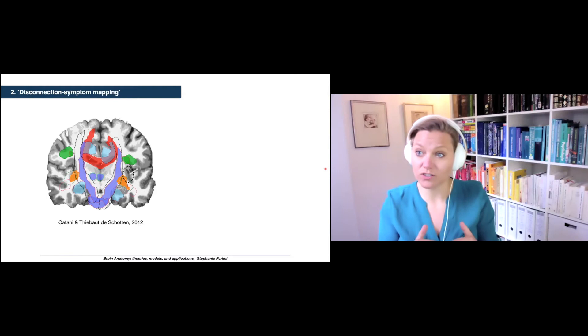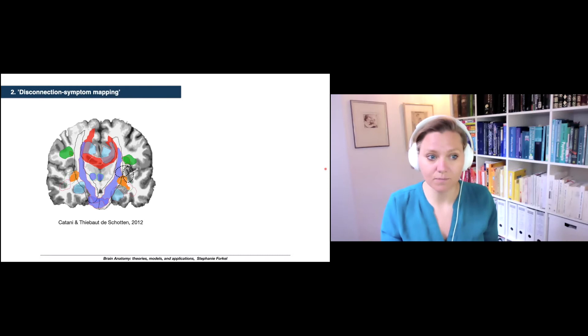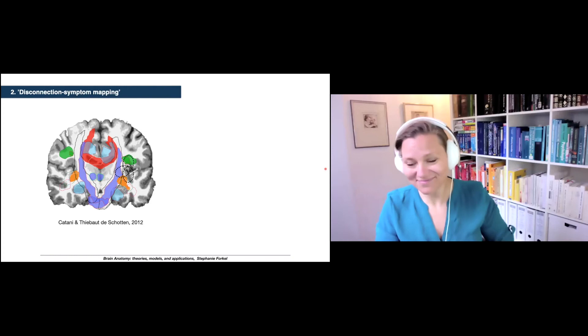If we have a lesion there, if that lesion extends ventrally it will impact on the optic radiation, that's the orange fiber tract that you can see here, and that would lead to symptoms like hemianopia or visual agnosia. If, however, that lesion extends more medially, it will then impact on the corticospinal tract and most likely cause a hemiparesis or somatosensory deficits. If we extend dorsally, that lesion now impacts the arcuate fasciculus so we would expect to see language deficits in those patients.